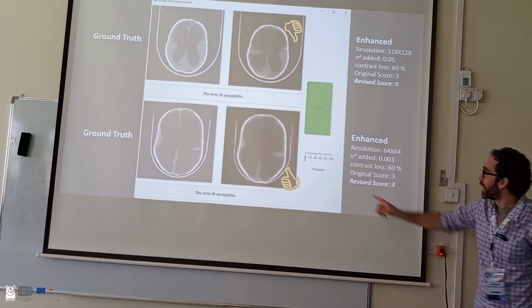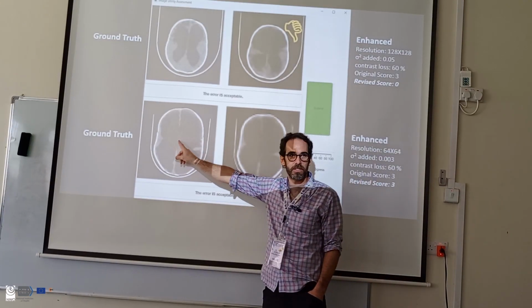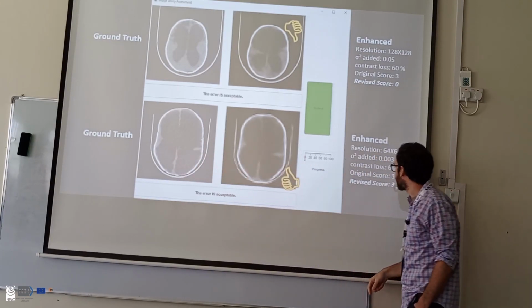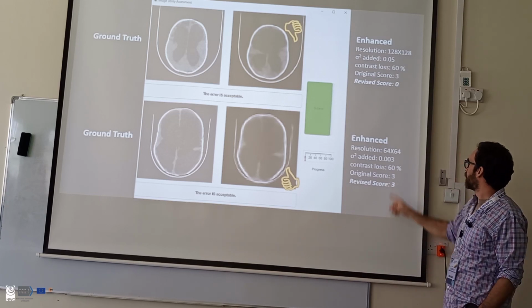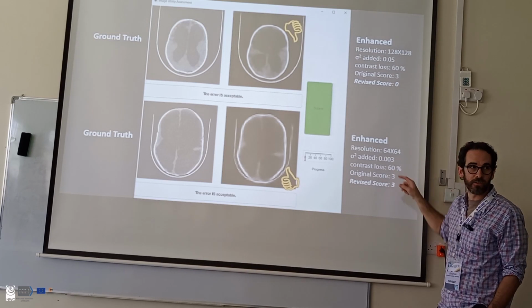So that's important. It does work sometimes. They all liked this one. They thought it matched the detail well enough for them. And they kept with the score. This had much less noise, but still quite a bit of contrast loss in the original case.